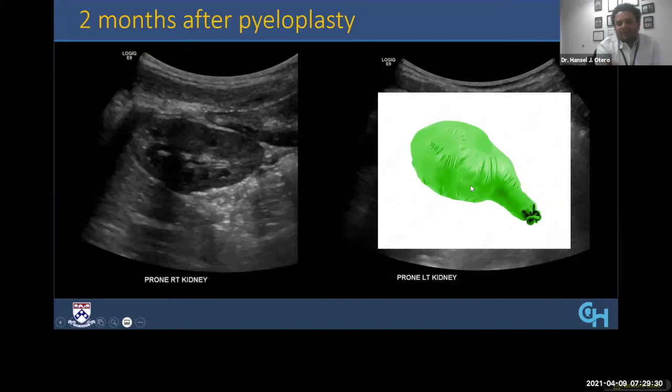All right. So again, remember this analogy because recognizing that these patients are not obstructed is the goal. You're going to recognize that this is something patulous and dilated, but it's not obstructed. Hence, doesn't need any further intervention.